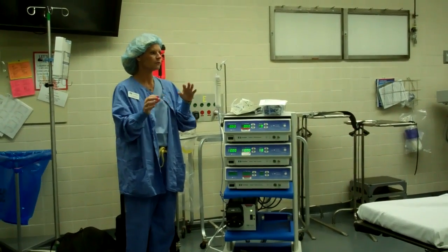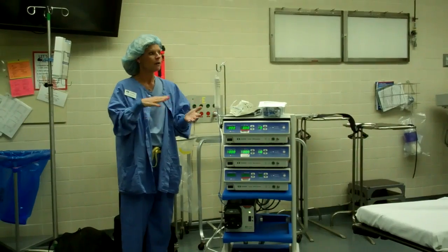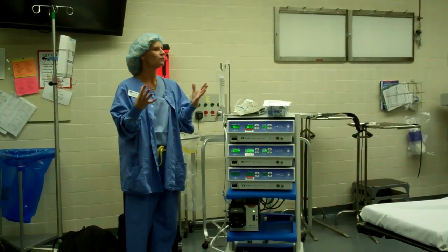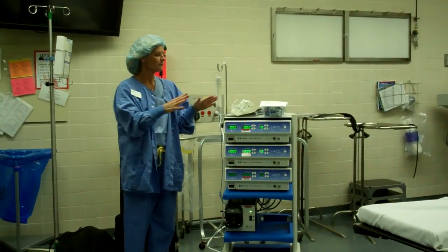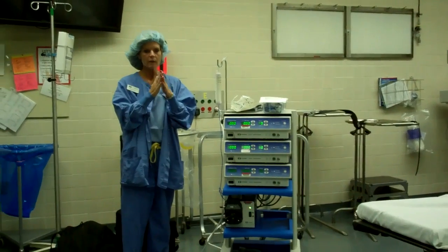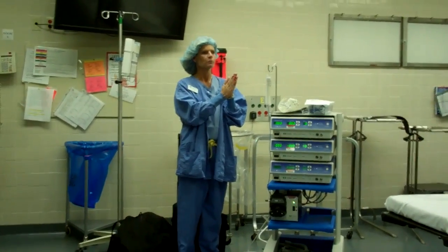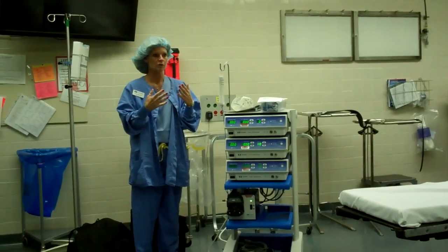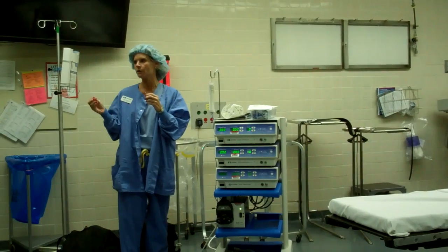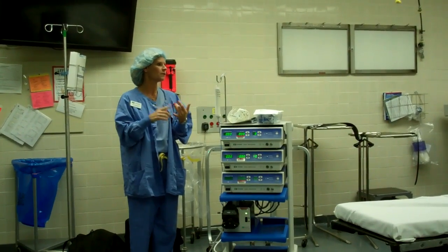I'm going to start by telling you the difference between radiofrequency and microwave. They're both heating — you're heating liver tumors. RF and microwave are just different points on the energy spectrum. With RF, it's lower on the spectrum, so there is current going through the patient and those wavelengths are longer. With microwave, you move up the spectrum and you don't need grounding pads because there is no current going through the patient.